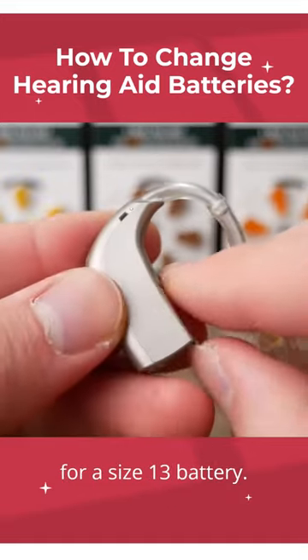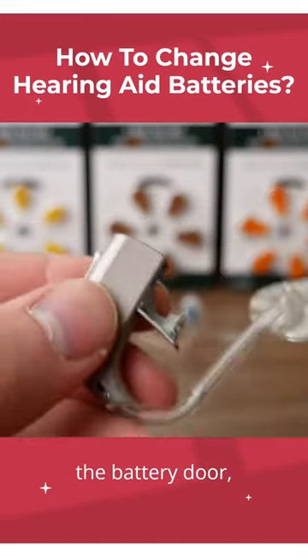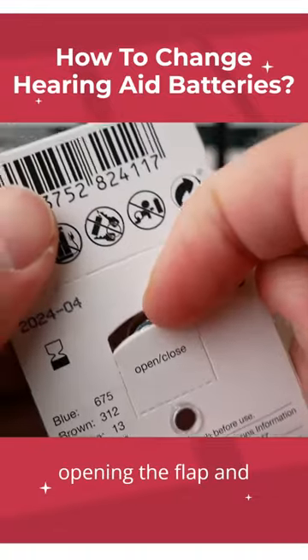Once again, the same operation, even for a size 13 battery — you want to be opening the battery door, taking a size 13 battery, and opening the flap.